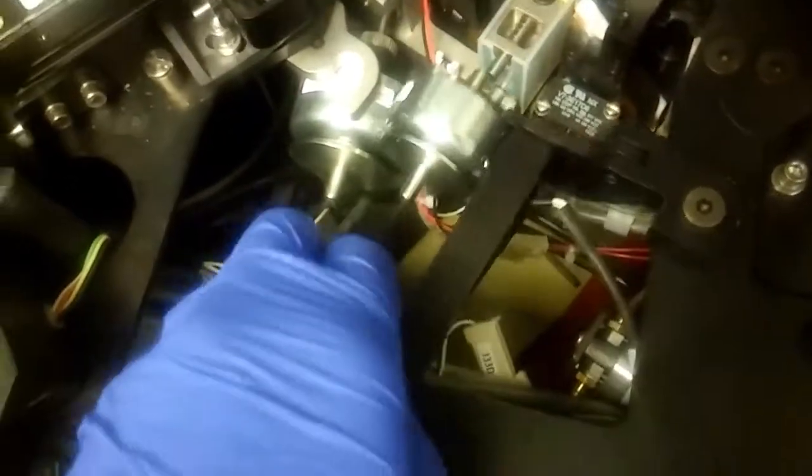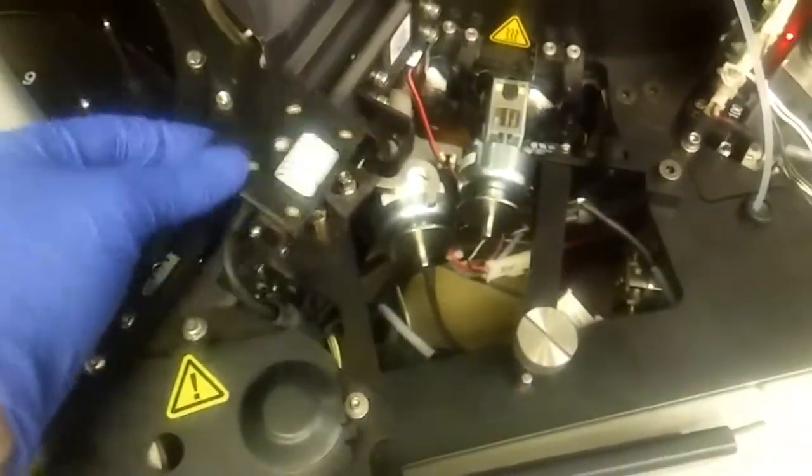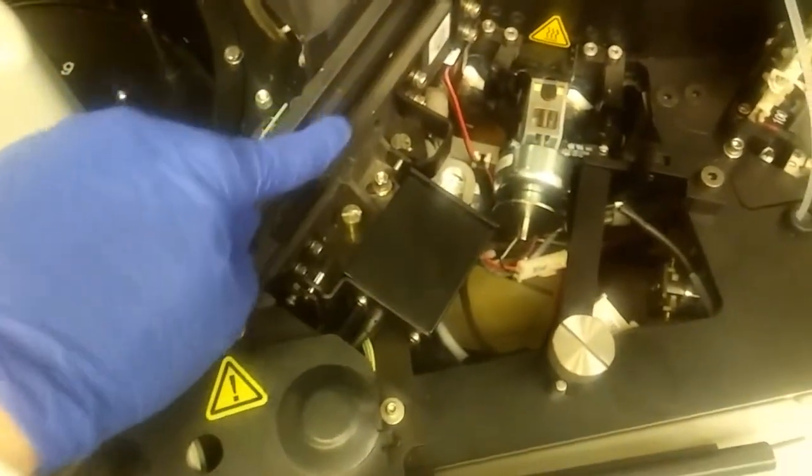You'll know it's in place if you push it in and it doesn't wiggle. Then put this back — those two will line up — and screw the knob back on. Don't forget it won't close all the way if this piece isn't put back down; that's the barcode reader for the flexes that go on.